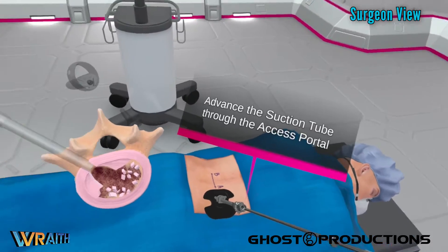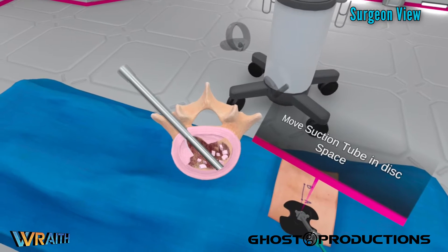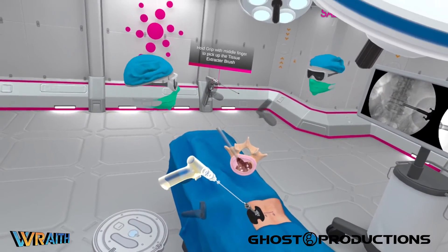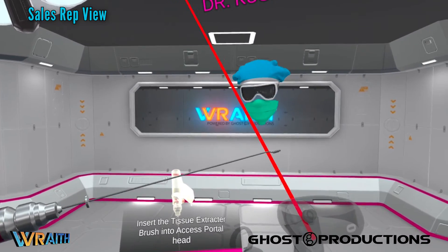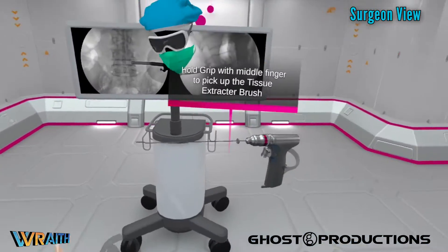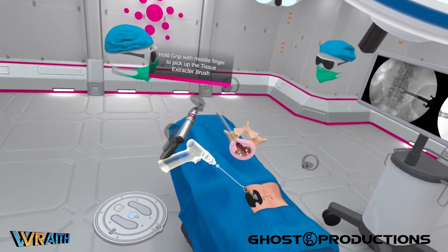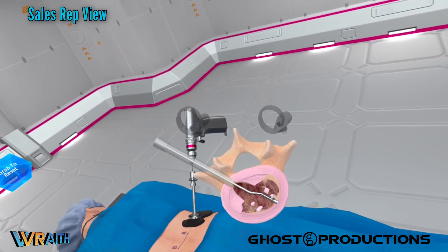This is a suction tube — now we can suck out the other pieces. How clear do we want this disc space? We're trying to get as much of the disc material as we can. This is a pin driver power unit — we've built this tissue extractor brush with a positive stop at the end. At the end there's a little wire brush that spins and oscillates. It's very flexible and can whip around in the disc space without damaging bone or disc material — it just collects loose disc material. It allows for a more open discectomy than just what the portal allows.